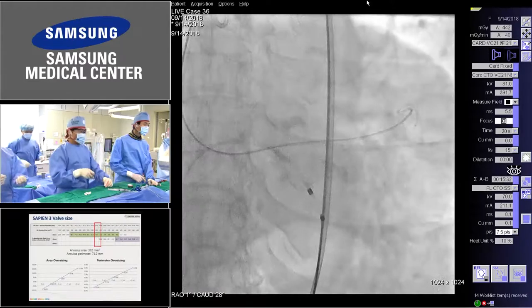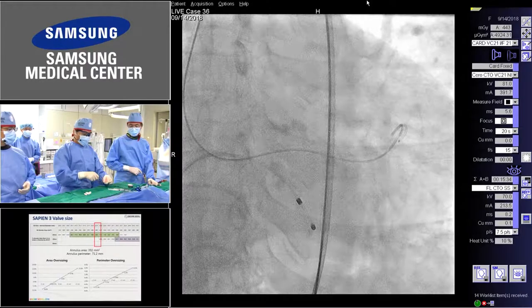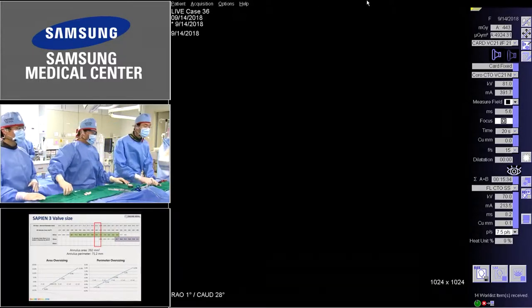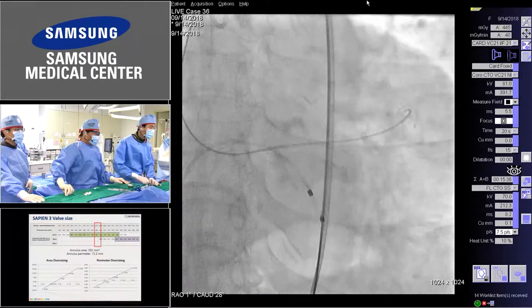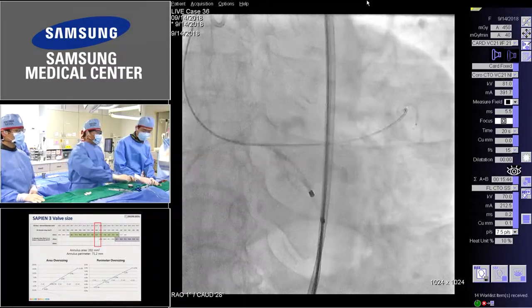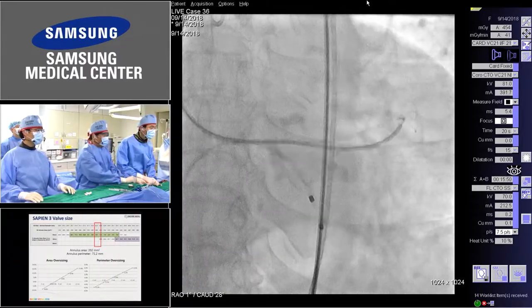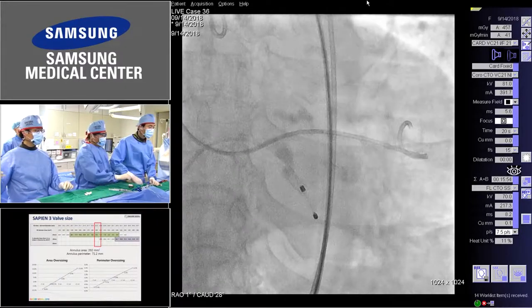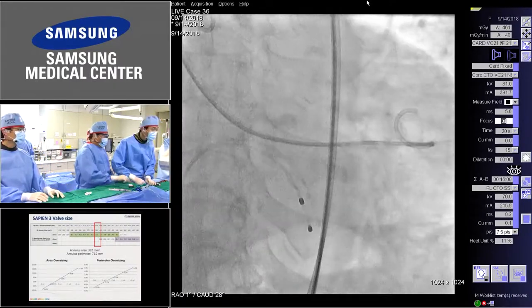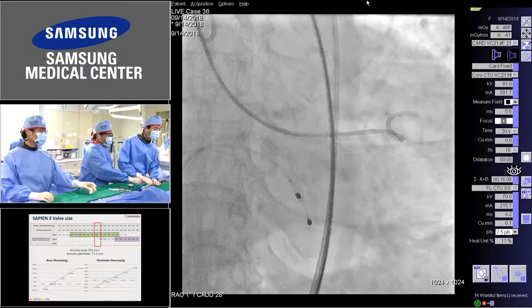You will do direct stenting in this case? Direct stenting. It depends on the case, but if it is a tricuspid valve, maybe direct stenting is okay. But this is a bicuspid valve, and the valve area is 0.7, so predilation is challenging. Dr. Grube, can you tell me what is better, what is not? What is the type of the guide wire? Safari. Now you are introducing the Safari wire. Safari wire, right. Okay. So the positioning is quite, it's a pigtail. What was the coronary height? Coronary 13. Wire to the middle.